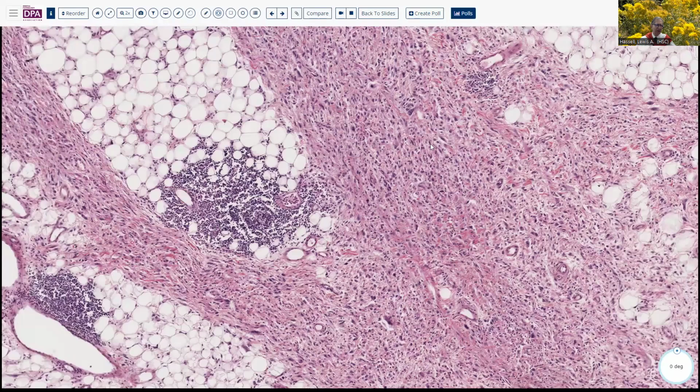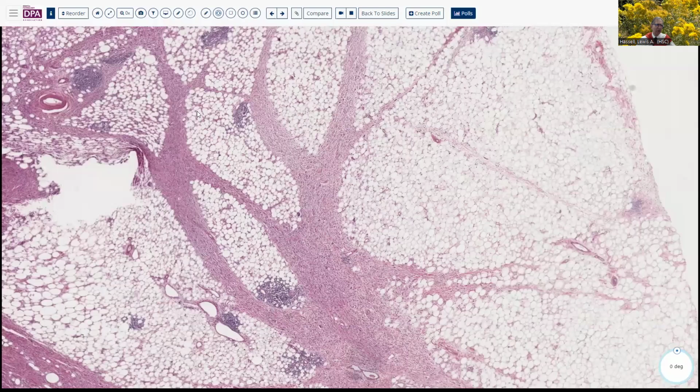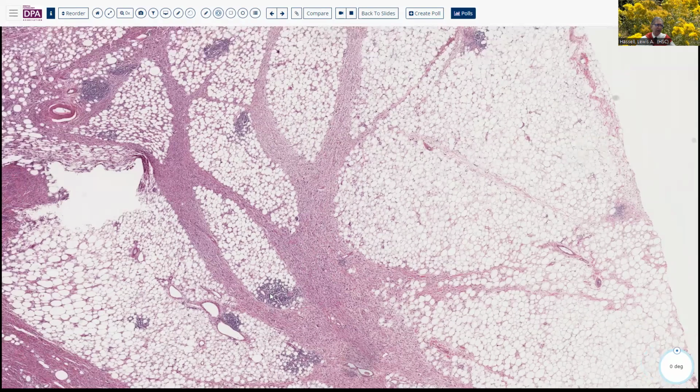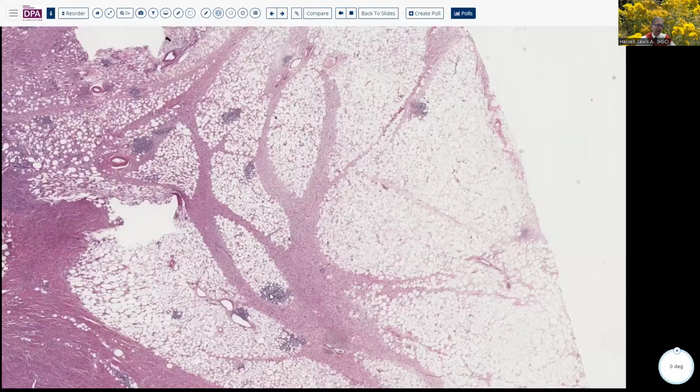Now, you don't need to shift the proportions here too much to realize that you got an exaggerated response of the lymphoid cells here, and a less prominent septal atypical cell component. You could be looking at something that looked very much like an inflammatory mass, very much like that sclerosing mesenteritis in the first slide that I showed you. So those are things to be considered as you look at that possibility.